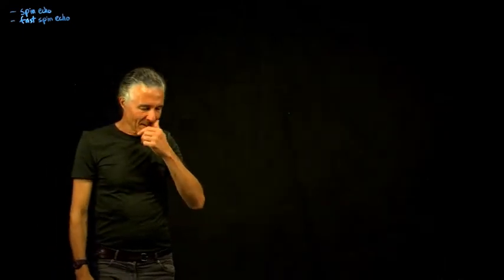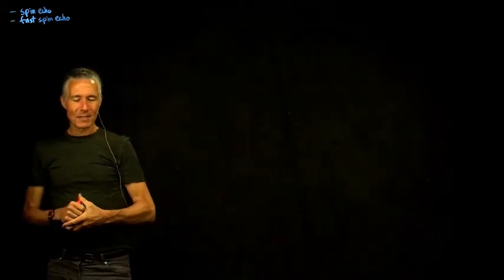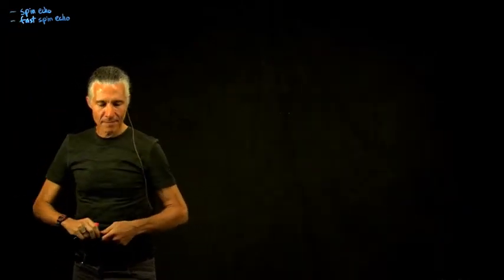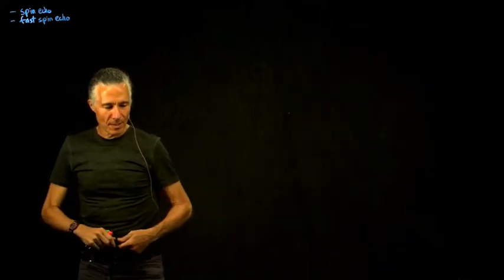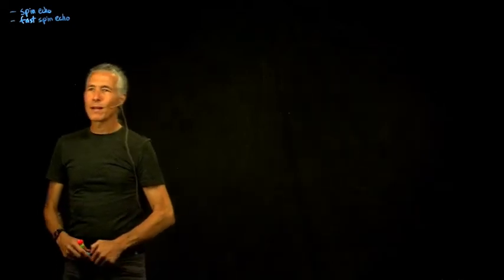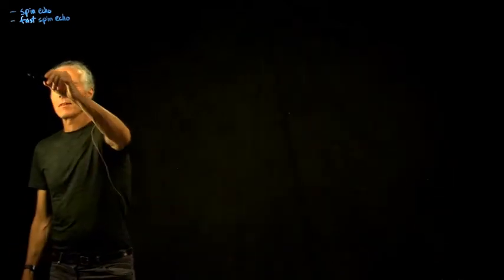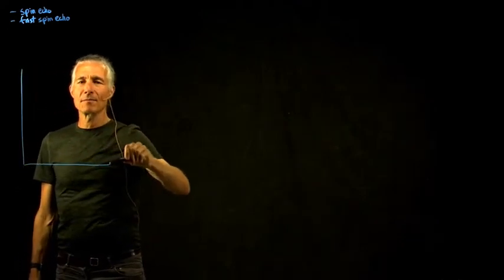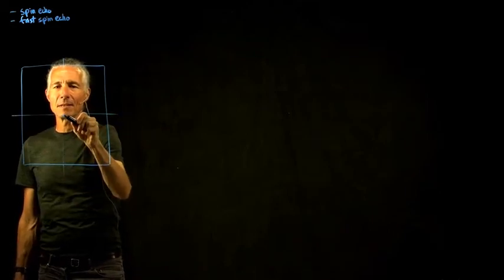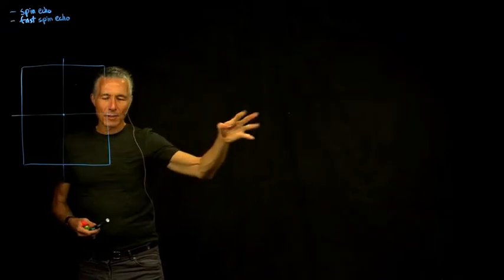SpinEcho. So back in the day, about 1990, when I was first doing some scanning, we would actually do this original slow SpinEcho. So I'll go over that one first, because that looks just like our original diagram of SpinEcho. And so we'll go over the pulse sequence diagram and then where we are in K-space. Here on this side we'll have the K-space. There's the center of it, and then we'll draw the pulse sequence off to the right.